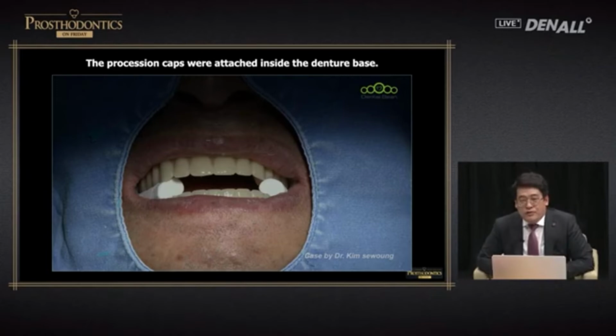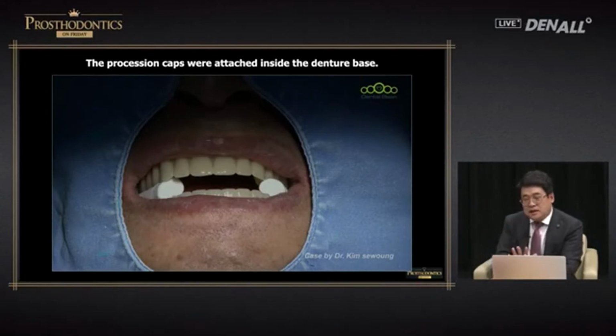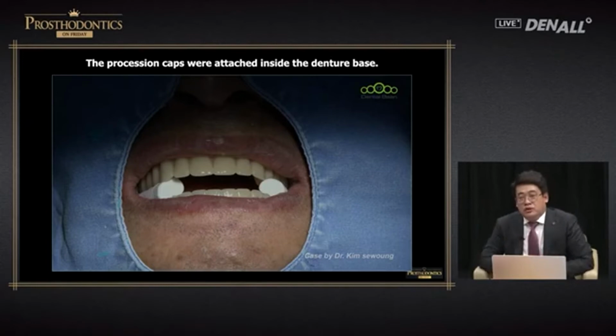If you're too busy and if you want to have the patient bite, then have the patient bite on the cotton roll. Because when you create denture, there can be deformations, and therefore to increase the biocompatibility, have the patient bite on the cotton roll.